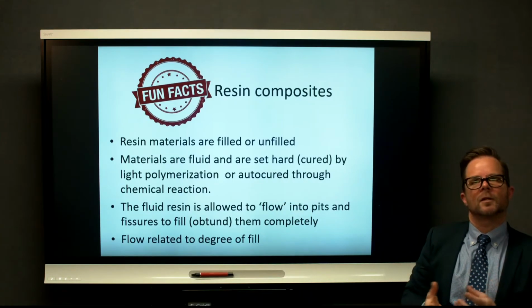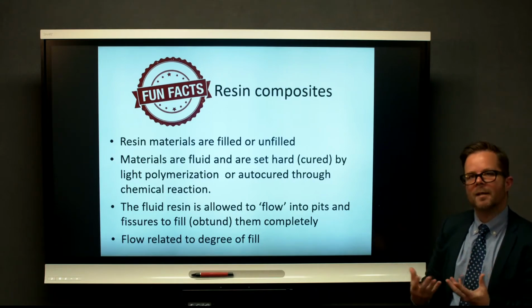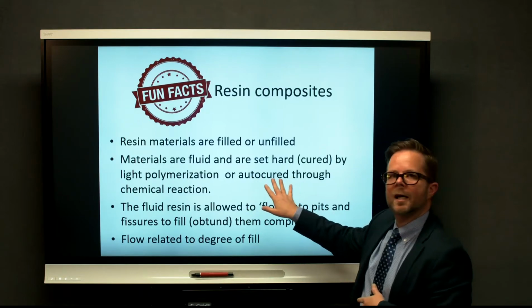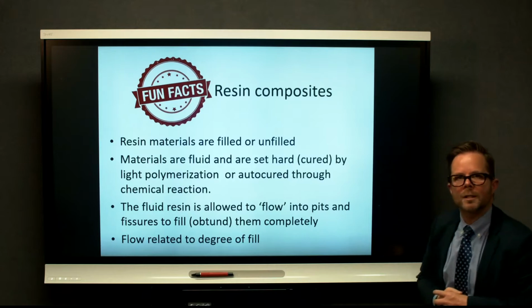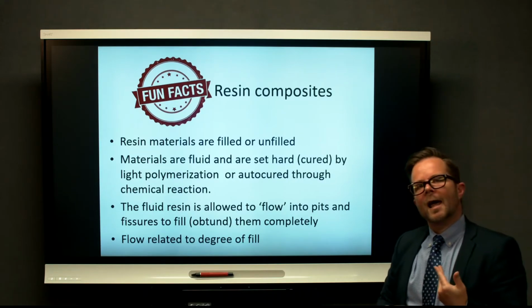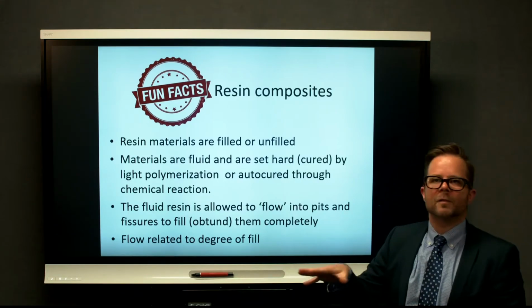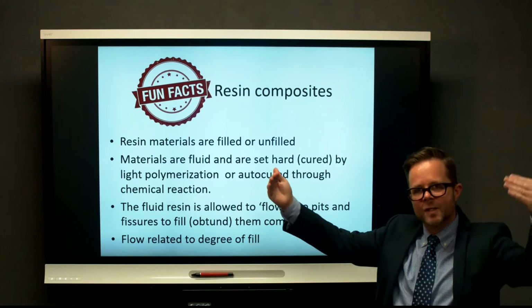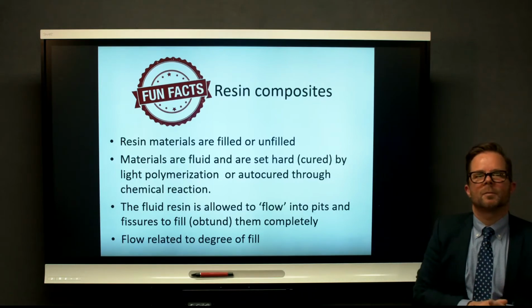So as soon as the powder and the liquid are mixed together, they then start to cure. All right. You may come across some of these in clinical dentistry, but mostly these days we'll use light cured or light polymerized resin composites. The fluid resin allows flow. Okay, so we want the resin to flow into the pits and fissures, to flow along the pits and fissures, and we want them to flow down as far as possible into the base of the pits and fissures.